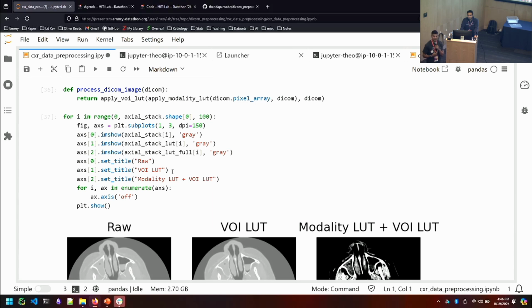Transformation, okay, of pixel intensities, right? Why are we applying a transformation of pixel intensities? Make contrast. Okay, redistribute the pixels on the images. Okay, good. So avoid outliers, right? Super intense or super washed out images.